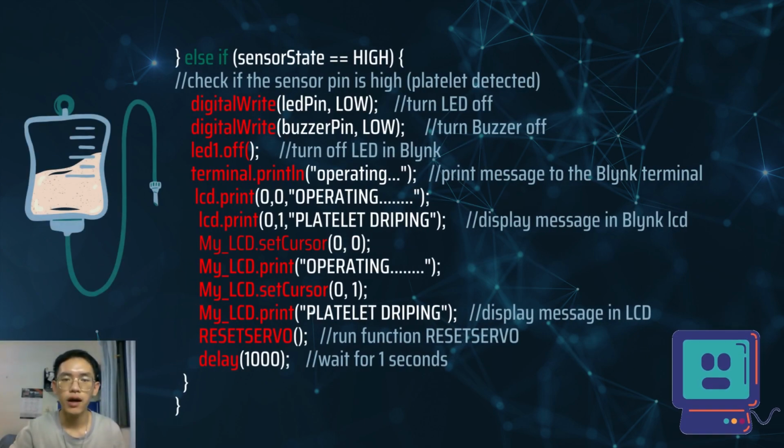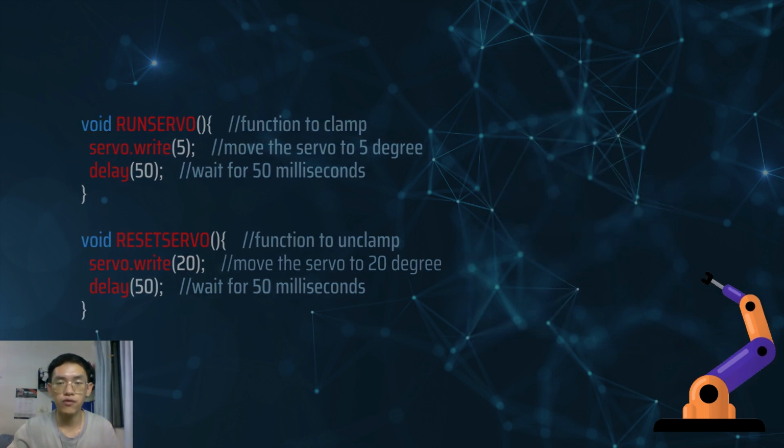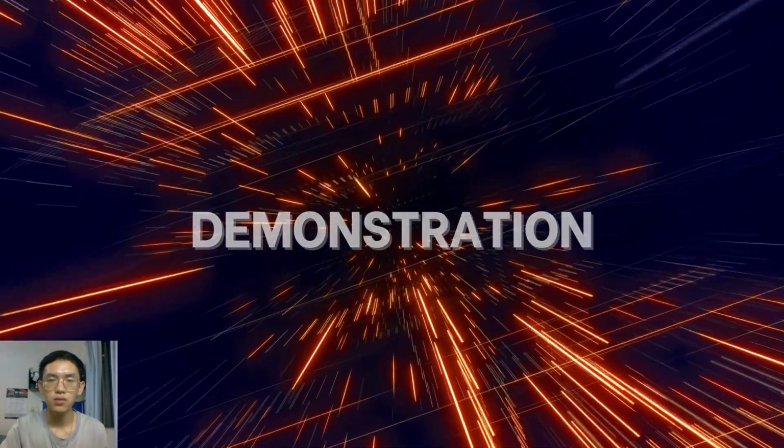If the sensor state is high, which means the platelet is detected, then the system will go back to the normal monitoring state. It turns off the LED and buzzer, and the LCD will display "Operating, platelet dripping," and the resetServo function is called. The runServo function is to clamp the IV tubing when the IV bag is almost empty to stop the dripping of platelet. Servo write moves the servo motor to an angle of 5 degrees and waits for 50 milliseconds. The resetServo is to unclamp the clamper so that the IV drip can continue. An angle of 20 degrees is moved by the servo motor to open the clamper slightly and wait for 50 milliseconds. So, let's take a look at how the project works.